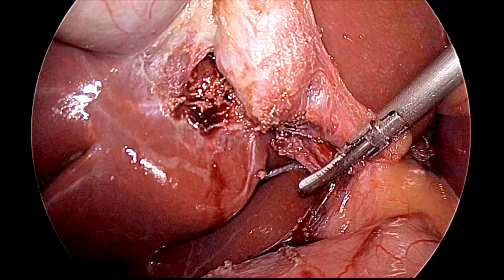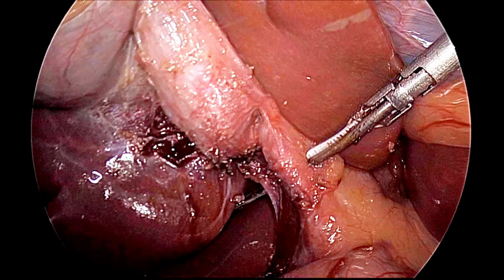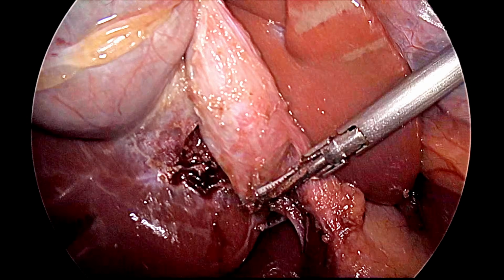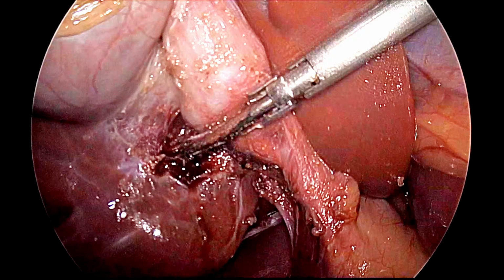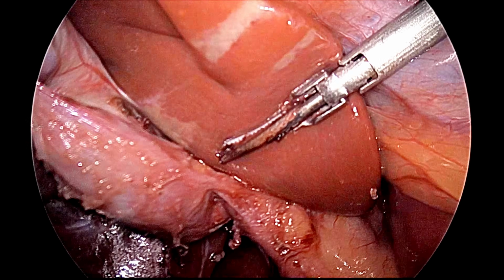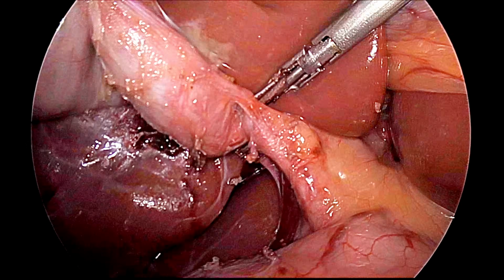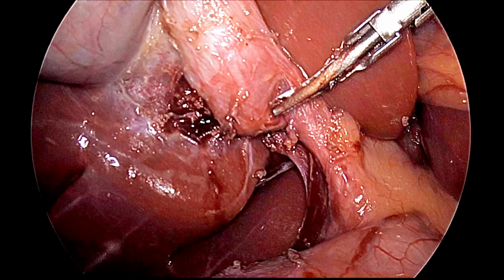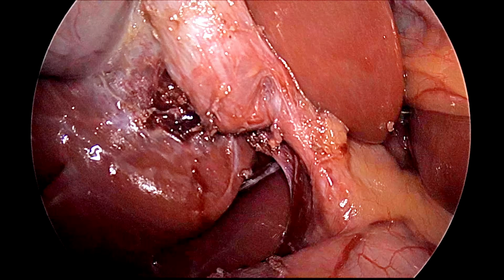We do not have any grasper to hold the Hartmann pouch. So this Storz mini alligator is just holding the body of the gallbladder, and then we will turn the ICG mode on. Here this is the artery, this one is the artery, and we can see a small lymph node is also visible. So again, the Maryland is required.